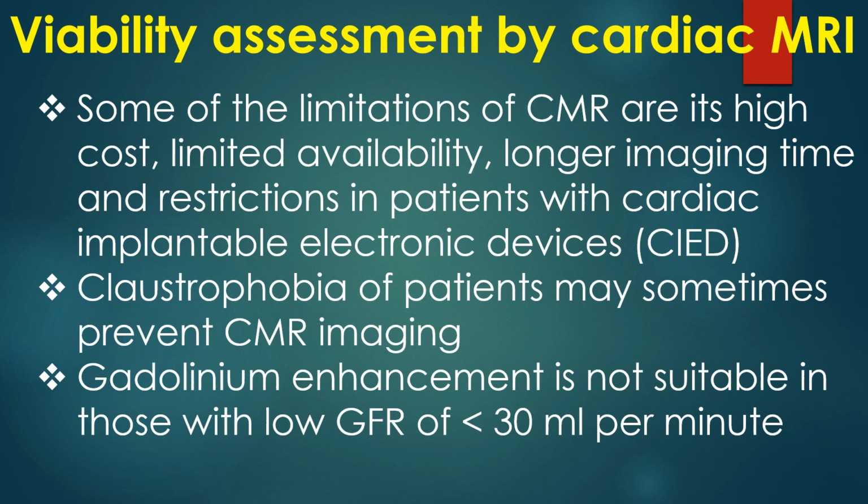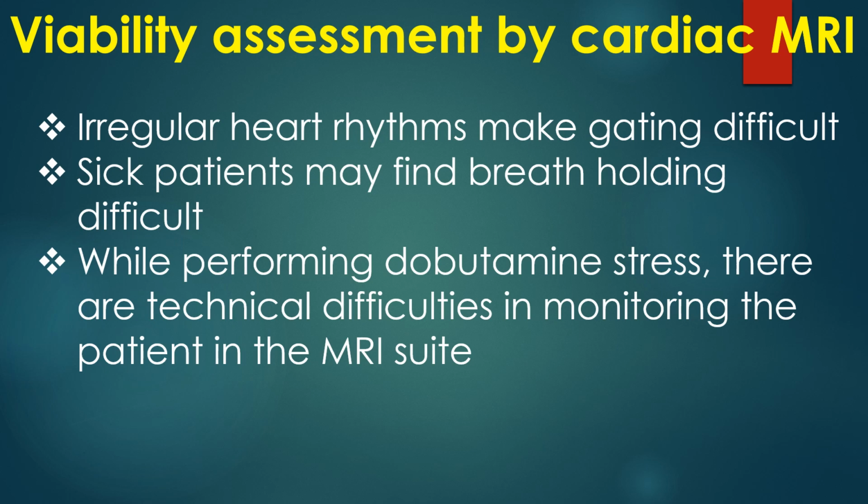Some of the limitations of CMR are its high cost, limited availability, longer imaging time, and restrictions in patients with cardiac implantable electronic devices. Claustrophobia of patients may sometimes prevent CMR imaging. Gadolinium enhancement is not suitable in those with low glomerular filtration rate of below 30 ml per minute. Irregular heart rhythms make gating difficult. Sick patients may find breath holding difficult. While performing dobutamine stress, there are technical difficulties in monitoring the patient in the MRI suite.